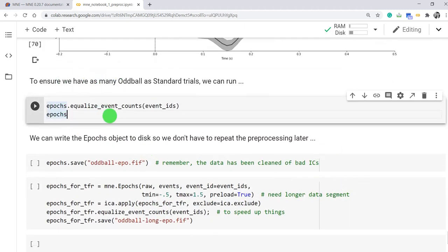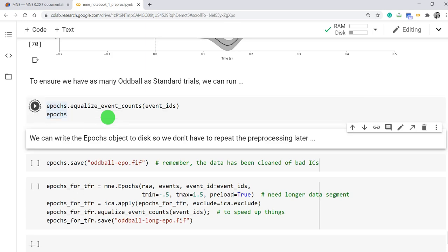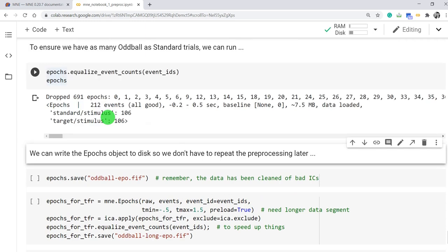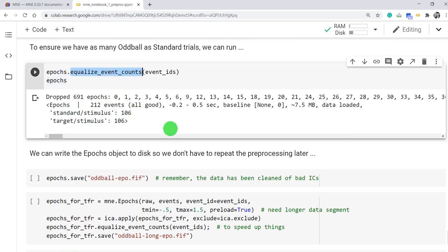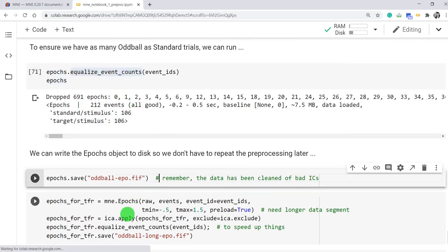So to ensure we have as many oddball and standard trials, we can run to equalize those unbalanced data. Look, from 80 to 20 ratio, we can try to select only balanced equalized event counts. Does that for us.